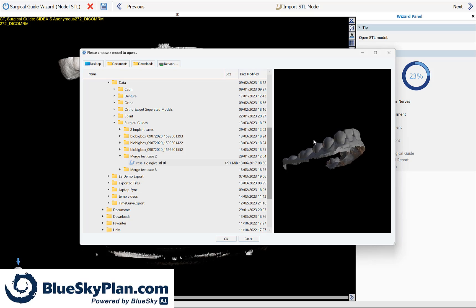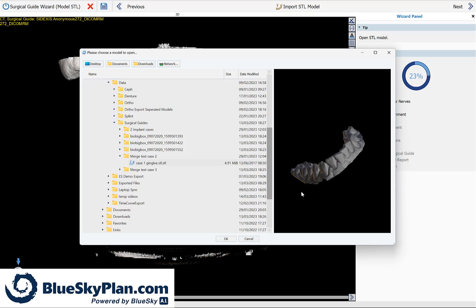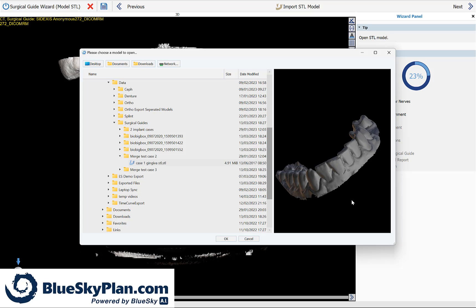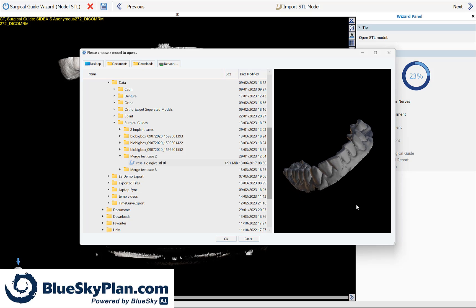You have a preview on the right-hand side that you can rotate by grabbing and dragging with your left mouse button or zooming in and out by holding the right button and moving your mouse backwards and forwards. Once you've selected the correct model scan, simply click on OK.